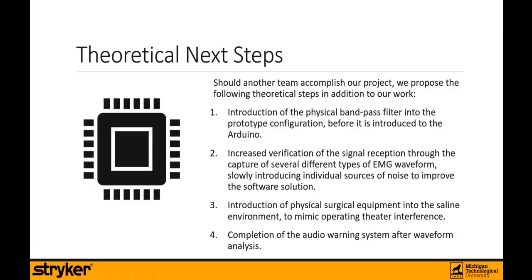Should another team choose to accomplish our project, we propose the following theoretical steps in addition to our work. Introduce the physical bandpass filter into the prototype configuration before it is connected to the Arduino. Increase the verification of the signal reception through the capture of several different types of EMG waveform, slowly introducing individual sources of noise to improve the software solution. Introduce physical surgical equipment into the saline environment to better mimic the operating theater, and complete the audio warning system after waveform analysis.